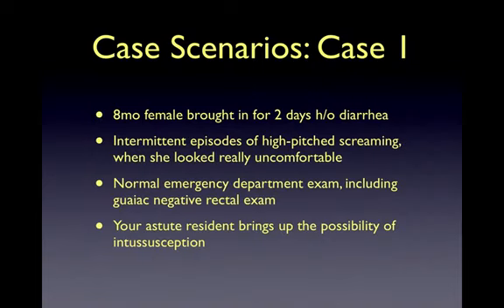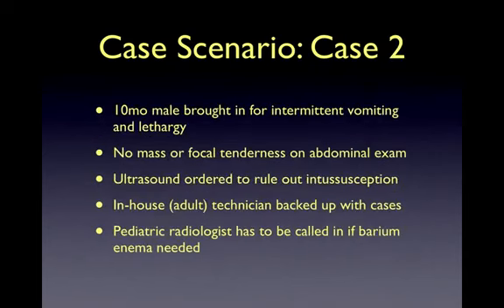Going back to the cases at the beginning, in the first case, we had low clinical suspicion, and a negative bedside ultrasound will allow us to comfortably rule out intussusception and send the patient home. In the second case, we had a moderate clinical suspicion for intussusception. A positive bedside ultrasound will allow us to expedite the care of the patient by putting in a timely call to the pediatric radiologist for definitive care. A negative bedside ultrasound in this case would prompt us to look for alternative diagnoses in this patient.